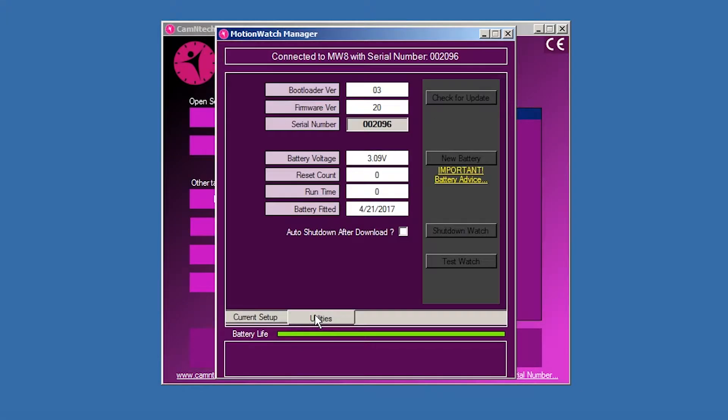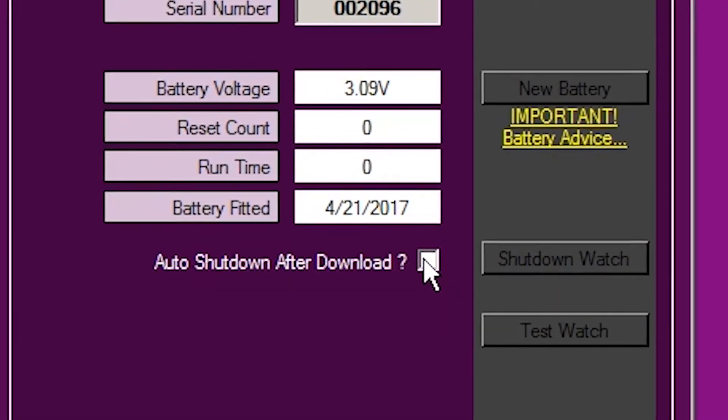The MotionWare software defaults to shut down the MotionWatch into sleep mode to save the battery following download. Data will not be lost, but the watch will cease recording. It is possible to disable this function if it is desired for the MotionWatch to continue to record following download and disconnection.